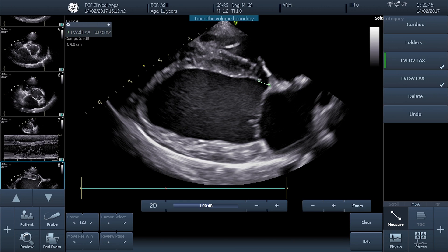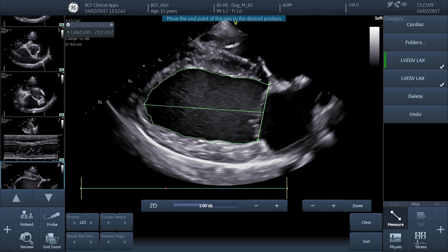Using our trackpad or trackball, we then follow or trace the outline of the left ventricular lumen — the endocardial surface — all the way along the septal wall, around the apex, and then out along the left ventricular free wall until we come to the mitral annulus of the posterior leaflet of the mitral valve. Press set again — that's the annulus just here. The machine will then draw in a second line that joins the septal leaflet annulus and the posterior leaflet annulus.